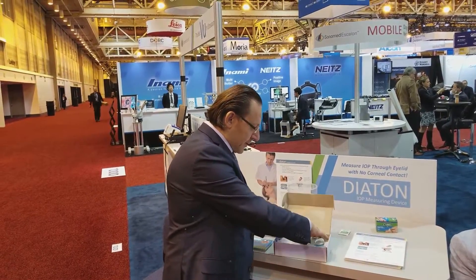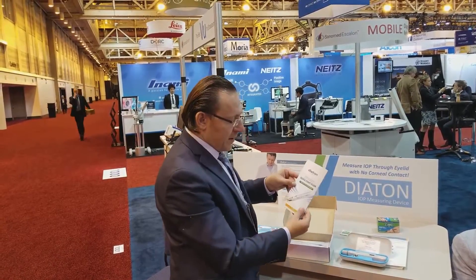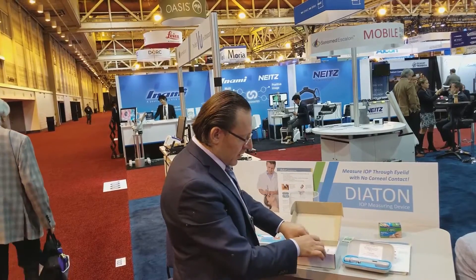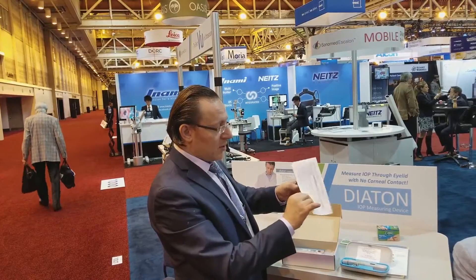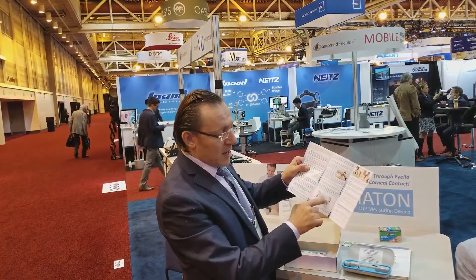Simply open the box and check out the device. You have a quick start guide which will show the correct and the wrong way of doing things — how to position the patient properly, how to work with the eyelid, and how to position the device. There's also a user's guide that will explain all the beeping signals and lettering on the display. Very straightforward step-by-step instructions with great images that elaborate and point out things to do and not to do.